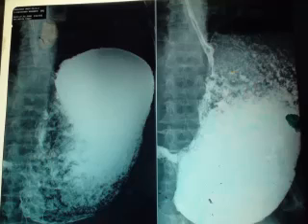So what can cause this huge dilatation of the stomach is duodenal obstruction or gastric outlet obstruction. So it's named gastric outlet obstruction, and usually it is due to cicatrized or chronic duodenal ulcer. It's a very common and important complication of a duodenal ulcer, which is fibrosis in the duodenal bulb with failure of the dye to pass through the duodenum into the small intestine, with dilatation of the stomach.